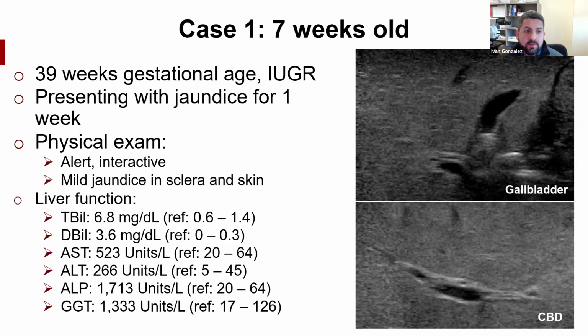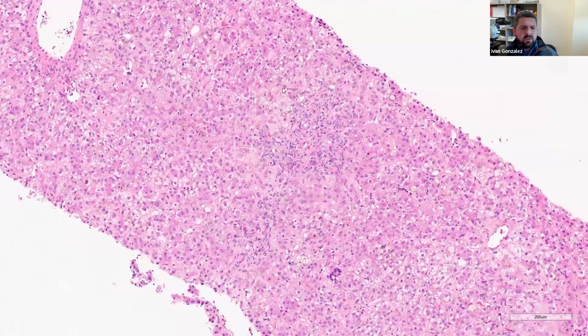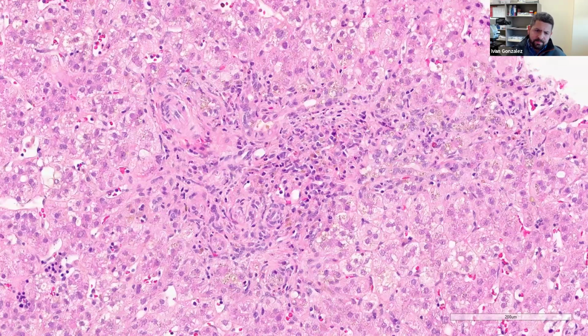So this is our biopsy. Looking first at the lobule, there's some steatosis, then you also have some giant cell transformation. There's some cholestasis, and I got a closer photo to pay more attention at the portal tract. Looking at the portal tract, there's a couple of things. One, you are seeing a duct injury. For instance, about the duct here, there's definitely some duct injury. And there is some cholestasis, some bile plugs within the lumen of this bile duct too.